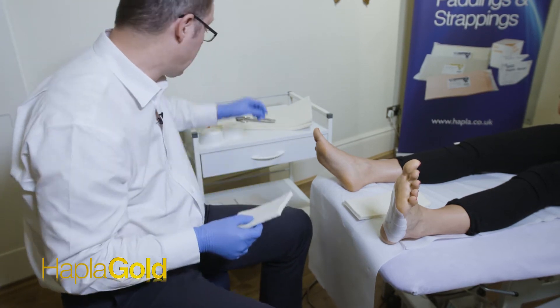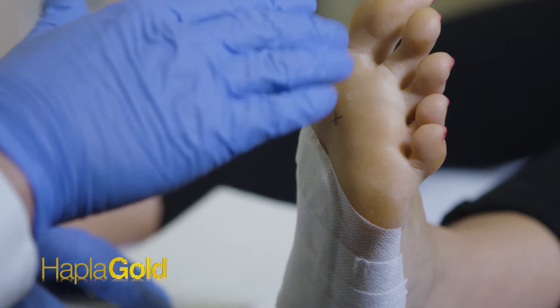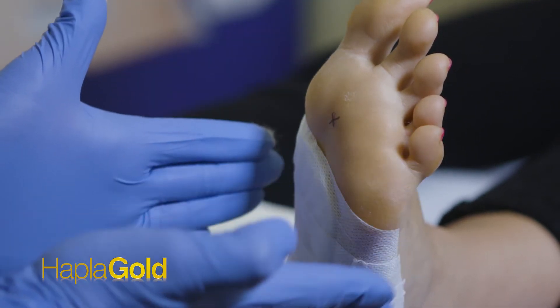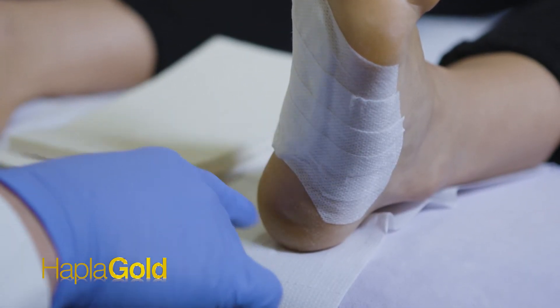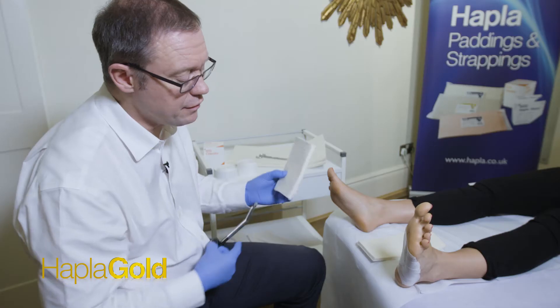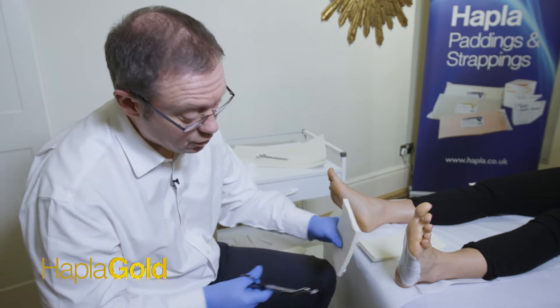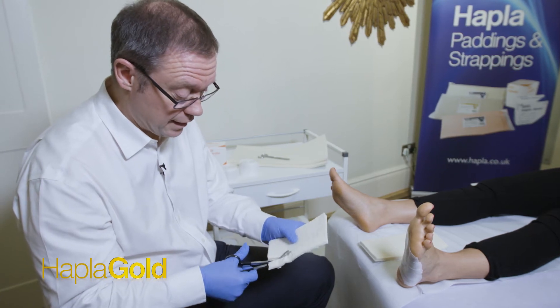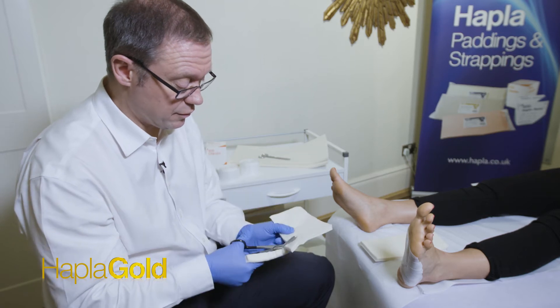Now we're going to cut the plantar slab. This has to end slightly proximal to the toe webbing, follow the lines of the lateral and medial borders of the foot, but end just where the heel fat pad really takes shape over the heel, because we don't want to put any of this felt over the heel. We do this because whilst offloading the area we're trying not to create a limb length difference, so we leave that heel portion out of the padding reach.